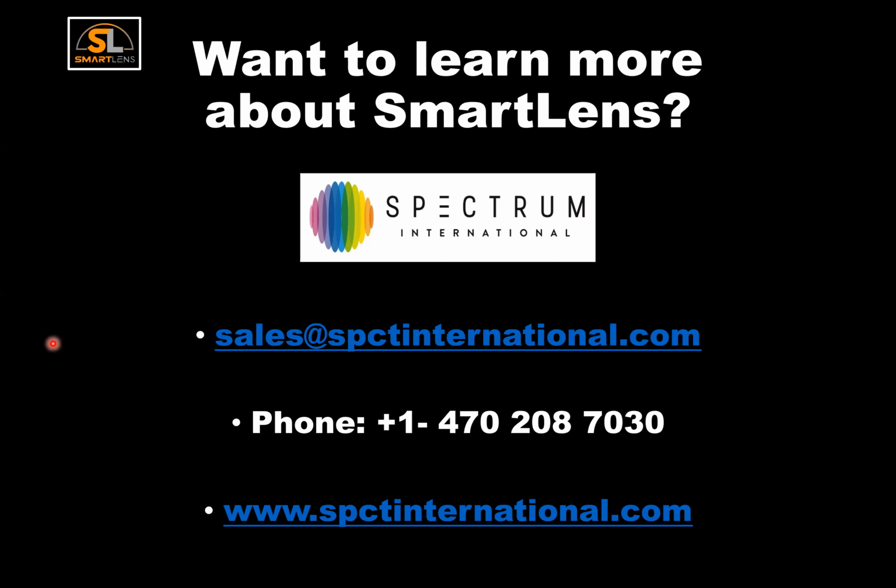I want to be very clear with everyone out there regarding multifocal scleral lenses, and the SmartLens is no different. It is critically important that we have good centration of the lens because, of course, as many of you know, scleral lenses typically position temporal and inferior, but our pupil and our visual axis is nasal and superior. So if our scleral lenses are going to be positioning down and out and our line of sight is up and in, or nasal superior, then these lenses may struggle to provide patients with good quality of near and distance vision.